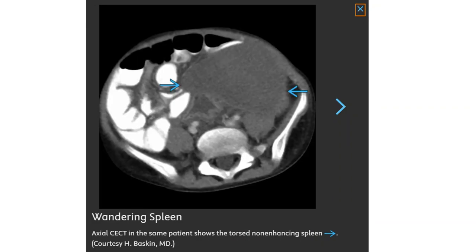Again, this is the contrast-enhanced CT in the same patient showing the torsion and non-enhancing spleen.